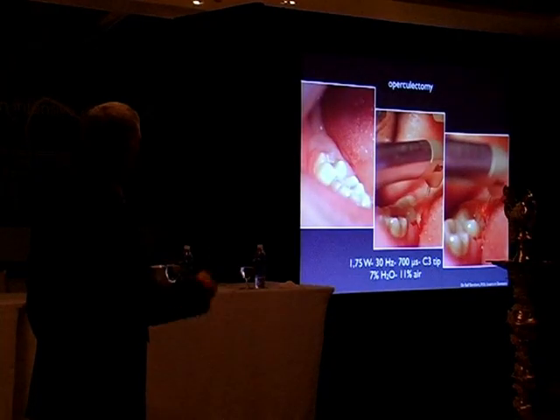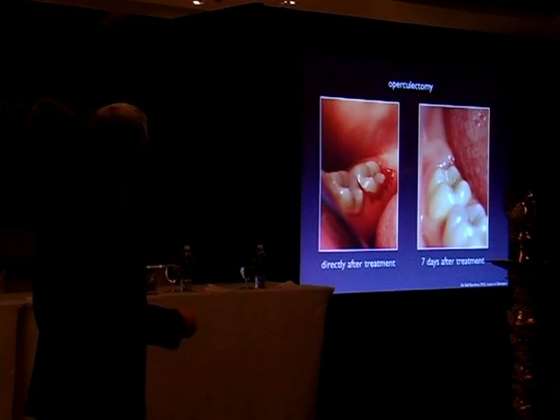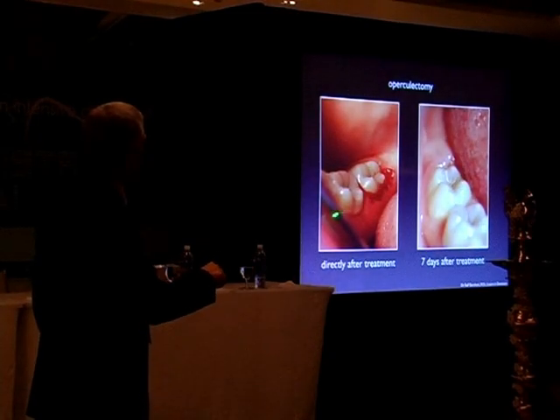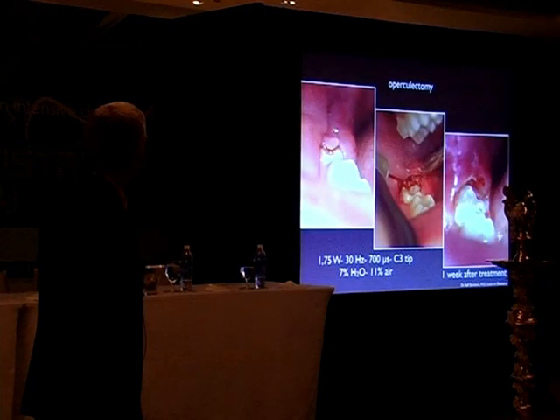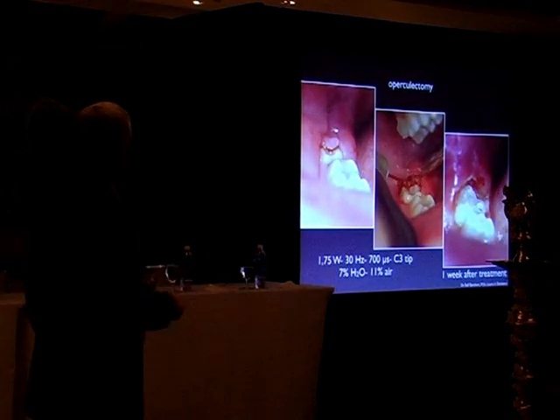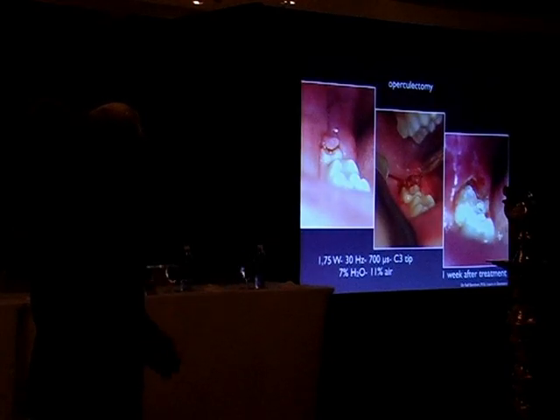Second case, and you can see it here, again with a long pulse, and even here, a little bit of bleeding, but a very good healing 7 days after treatment. And next case, a little bit of bleeding, but a good healing.